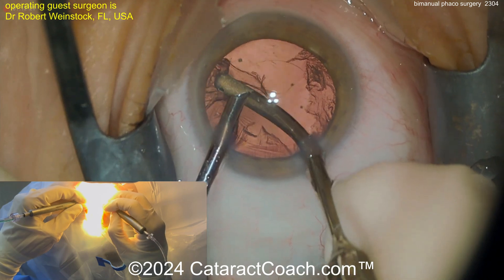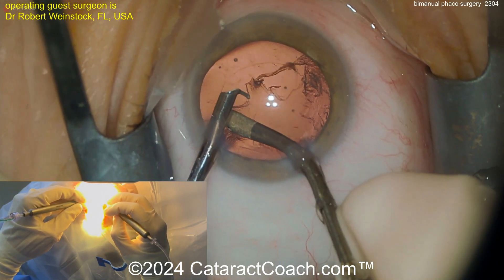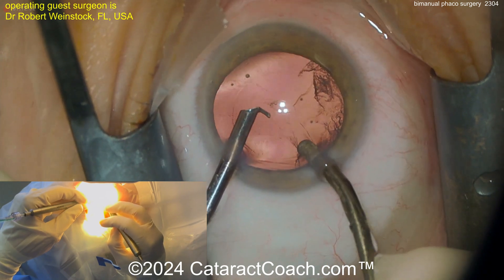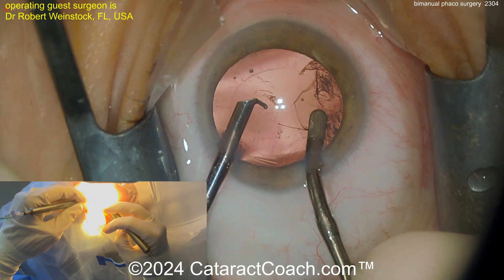Going back to the bimanual irrigation and aspiration — you're used to seeing this: left hand's infusion, right hand's aspiration. So the question is, if bimanual IA or bimanual cortex removal is better, why isn't bimanual phaco better? And it's a reasonable question.